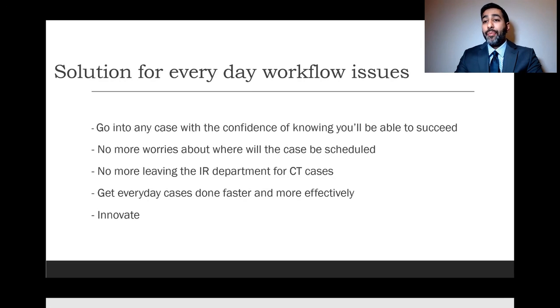You know, you can get any case done, whether it's a tough access on a gastrostomy tube or placement of a peritoneal dialysis catheter where you may need CT. There's just no hesitation. I'm very excited about future innovation. I don't see us practicing any other way, actually. It's very difficult now, once you get used to it, to see yourself practicing without it.